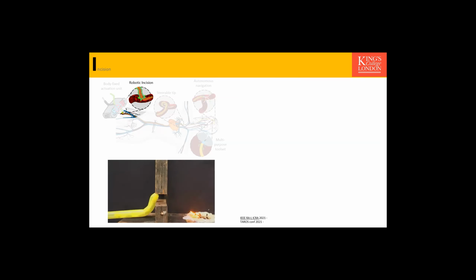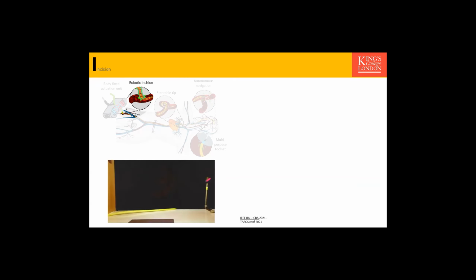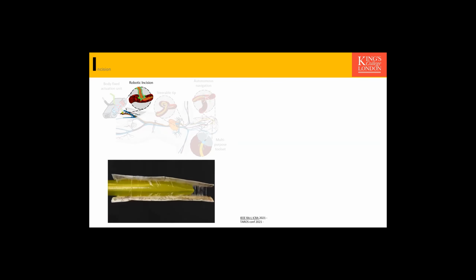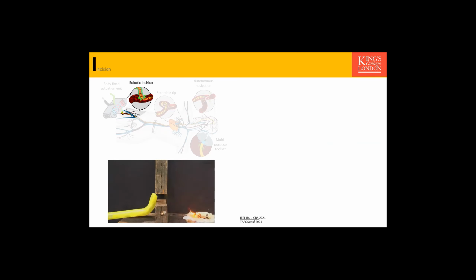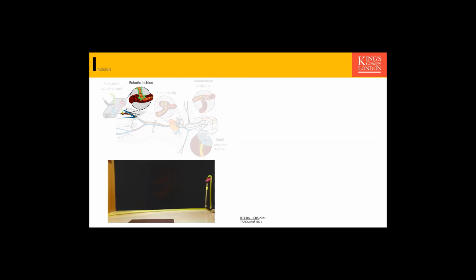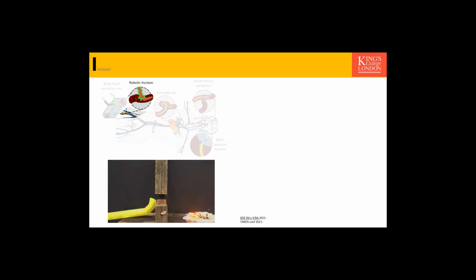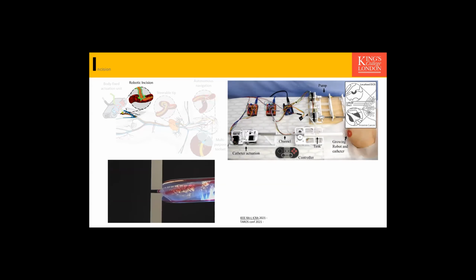The benefit is you don't need to push it against the environment. It remains stationary in place, so you don't have friction issues. Inside the body, you don't get all of the issues related to pushing needles through the tissue, because it stays in place. Also, as you can see in this video, it can go through very small openings. So you can have a small incision port, then expand it without the need to tear apart the tissue, just by compressing it.